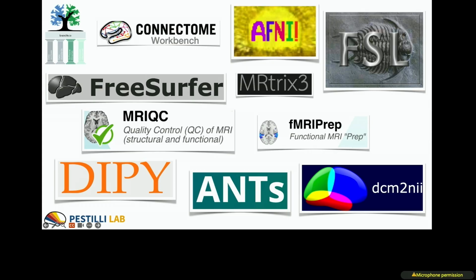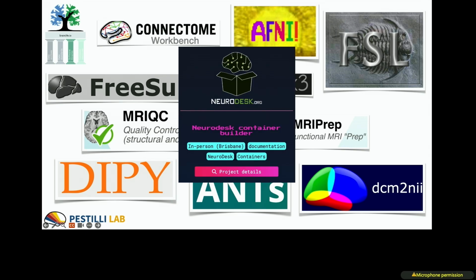And our third pillar is the software libraries. We support these amazing tools that the community built. So fMRIPrep, FreeSurfer, DIPY, we have them all converted into a certain specification that is supported by BrainLife. And together with Ashley and Joshua from the NeuroDesk team, we are now facilitating bringing new tools into the platform. So if you want to try another version of a certain tool, or if you want to try new tools, you can easily create your own and import this tool into BrainLife.